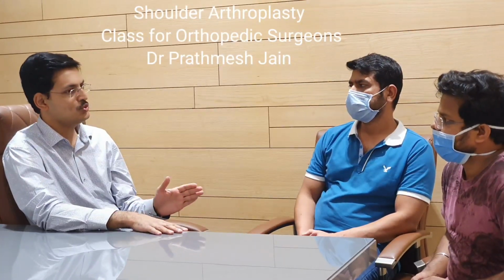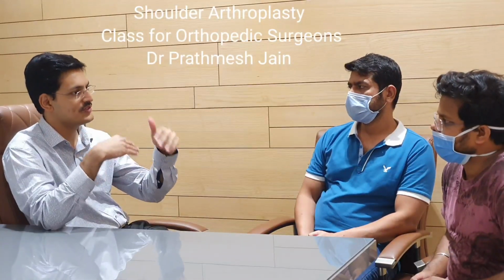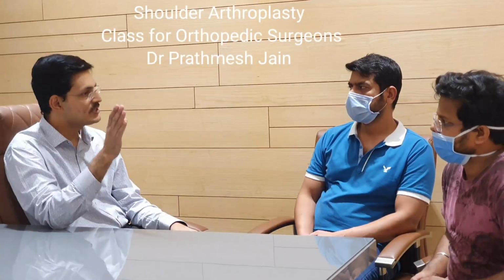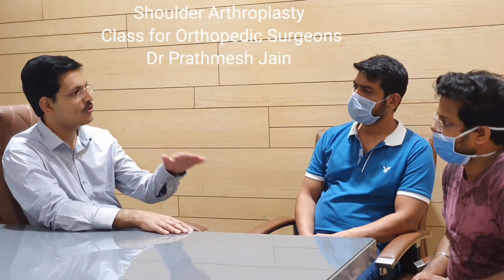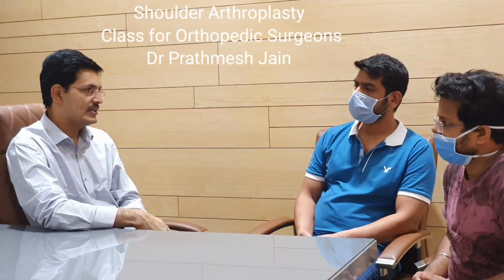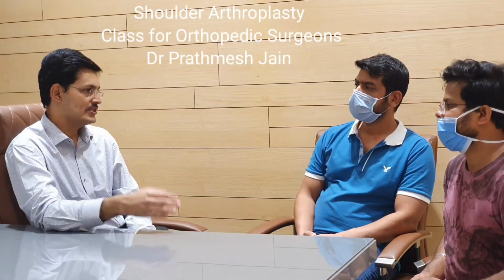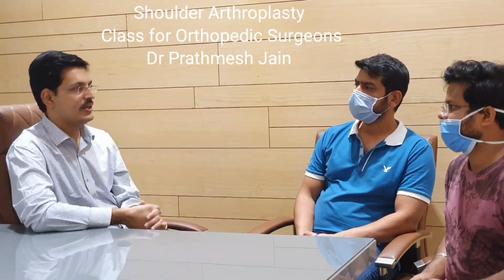Reverse shoulder arthroplasty usually relies on the deltoid tension, and you need to increase the vertical as well as the horizontal offset to increase the tension of the deltoid. So even if you don't have a rotator cuff, you will have a very good function in the shoulder in the absence of the rotator cuff also. That is why it has very good function in tumors and trauma cases as well, where you have to cut or remove the rotator cuff tendons. The biggest, or most common, complication after a reverse shoulder arthroplasty is dislocation. So you have to keep the soft tissue tensions right and maintain your vertical and horizontal offset.